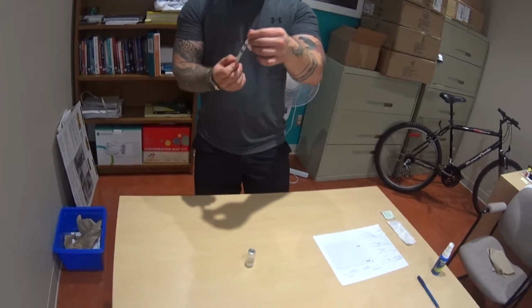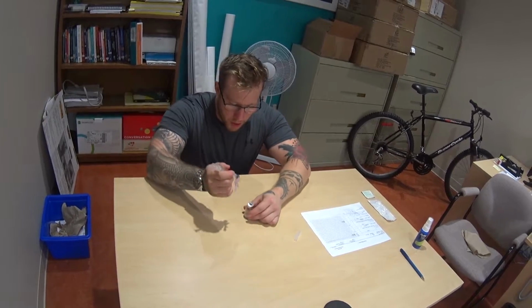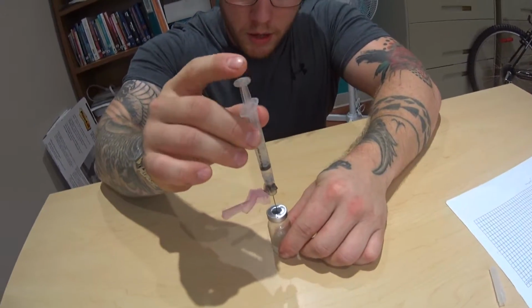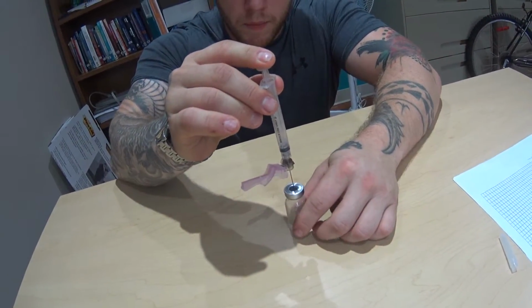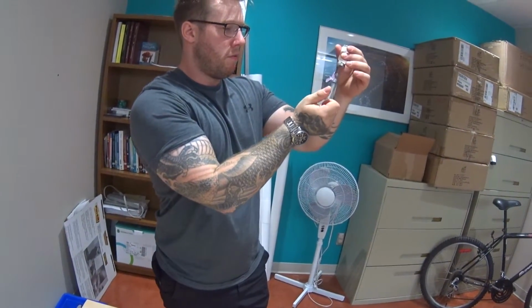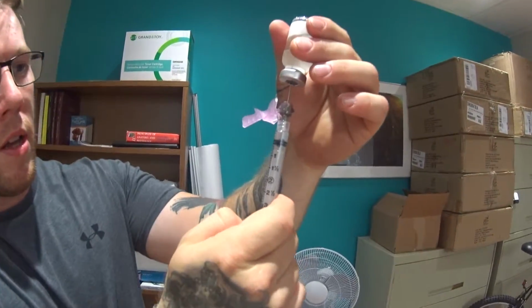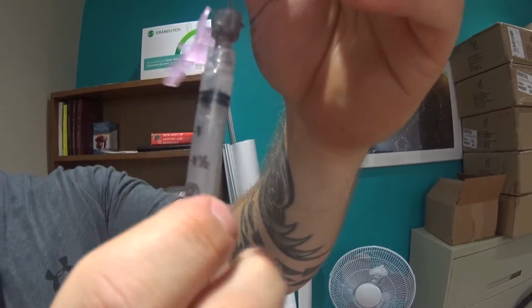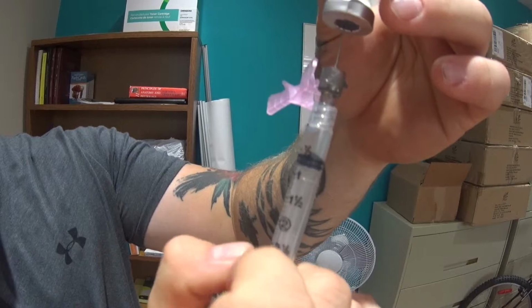I'm going to take the top of my needle and inject it into the vial. So I'm injecting the 0.5 milliliters of air into the vial to equalize the pressure. I'm going to come up and withdraw 0.5, ensuring no air bubbles, which is pretty difficult with this water here.